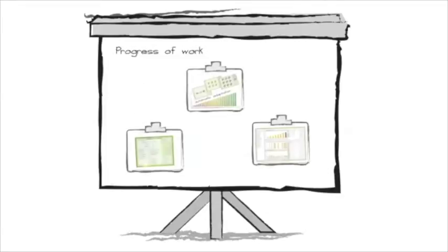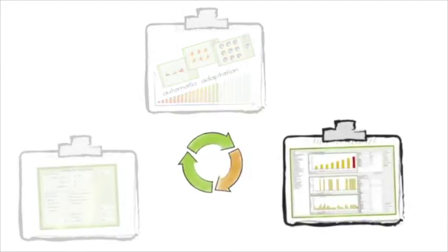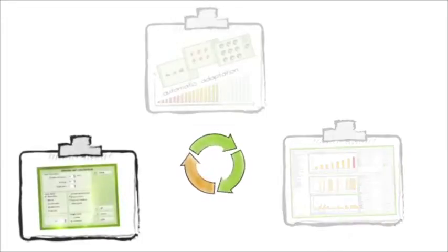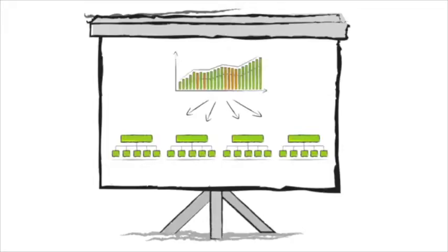In summary, the progress of work for one RIACOM module is now shown. The patient starts working with RIACOM at an easy level. The auto-adaptive mode keeps the difficulty of training at a level appropriate to the abilities of the patient. After therapy, the therapist analyzes the training results. When any adaptation is needed, it can be made in the parameters menu before the next therapy session starts. Your knowledge about the therapy module, attention and concentration, can now be transferred to all other RIACOM therapy modules because they follow the same principles and structure.